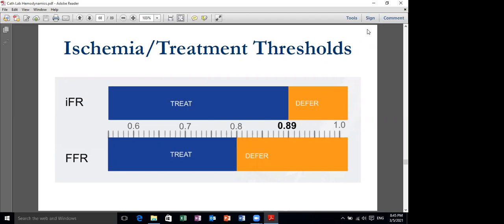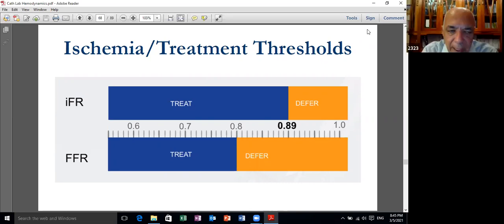Question: can CMR replace right heart cath for estimation of shunt fraction? All the things that the echo can measure, the shunt fraction.